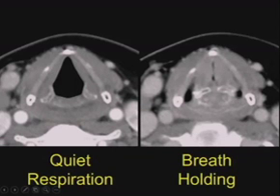Interestingly, if we do a technique called the puffy cheek that we use a lot in the oral cavity, if we scan the patient while they puff out their cheeks, we can see the inside lining of the buccinator in the cheek better. The tip of your tongue actually moves away from the mandible if you try to do it yourself, and we dilate up all these air-filled spaces. So the retromolar trigone and a lot of the air-filled spaces of the larynx all dilate up if we do that. So sometimes if we look at a patient and we're suspicious of those areas, we can do a thin second pass through that area.